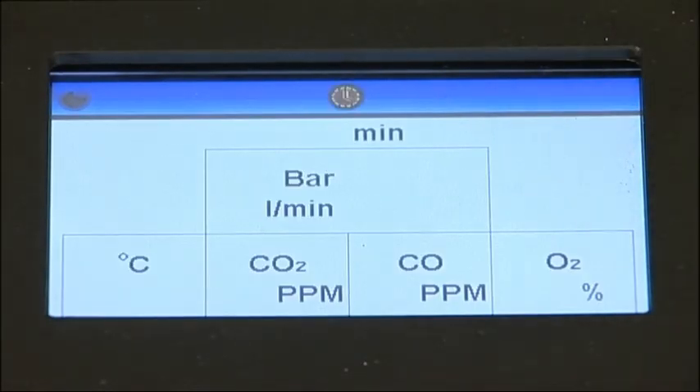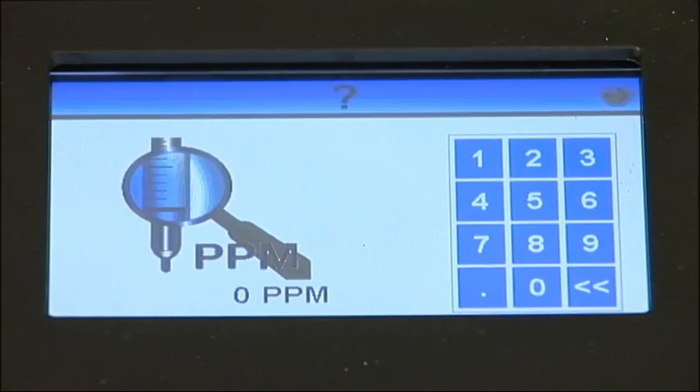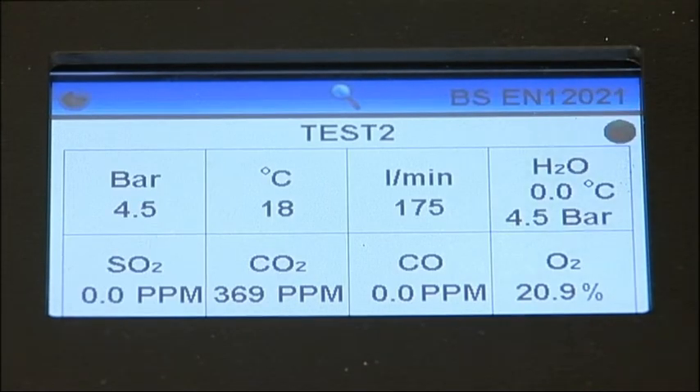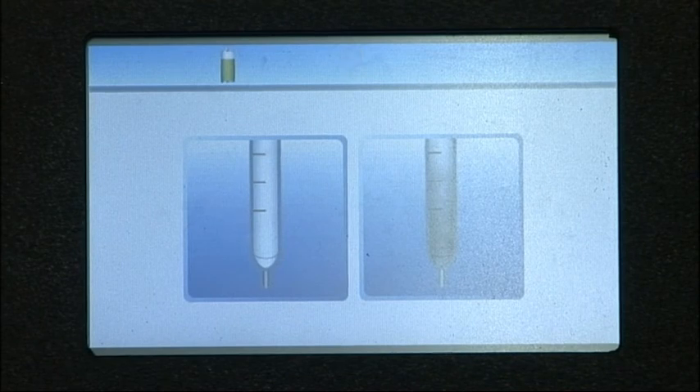The test will proceed as previously described, and at the end you'll be prompted to enter the result from the tube. For the nitrous fumes and sulphur dioxide tubes, enter the result using the numeric pad, then press the arrow in the top right-hand corner. For the oil and polytest tubes, select the appropriate Pass or Fail icons. The result will then be displayed on the final test results screen and stored in the instrument's memory.